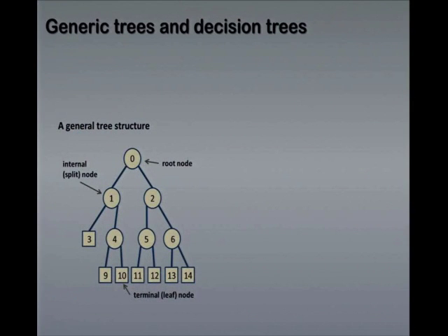If the computer has already detected, say, a bounding box for where the kidney is, then it would be almost instantaneous because it's so much less data. And you can also do this progressively. Then I click on the left kidney, I just get that, and then I get the heart and other things if I'm interested in other regions as well. So this sort of technology is good for software engineering as well. But how does it work?